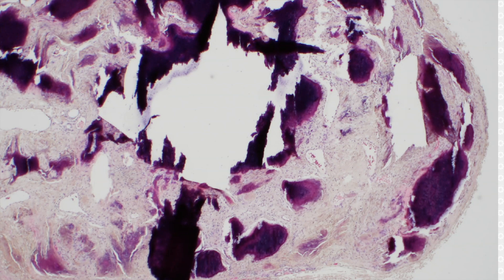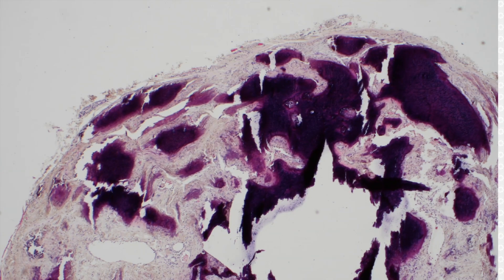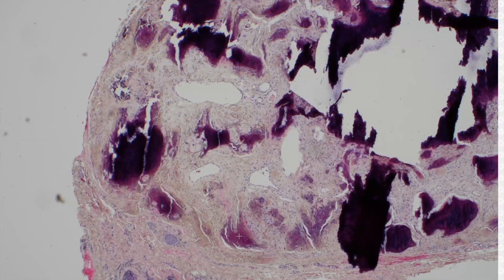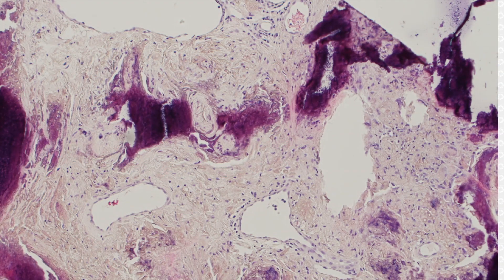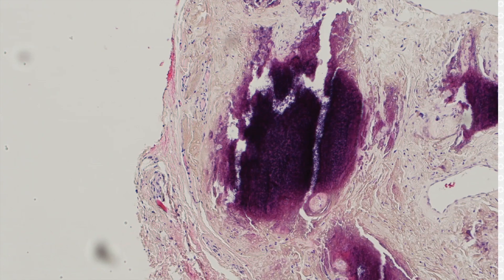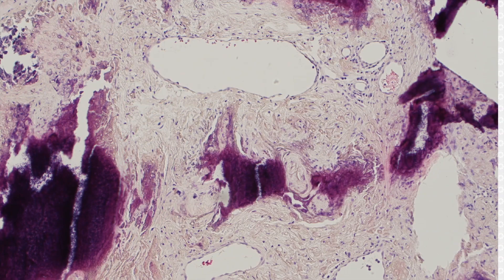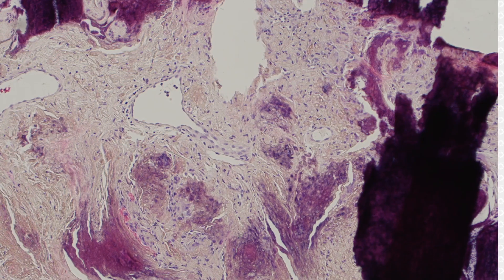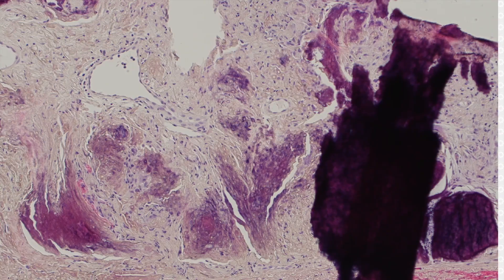What do you do with this? Pilomatricoma. A lot of times people struggle because when they're totally calcified, like this, pilomatricoma — when they rupture and totally get calcified — can get confused with calcinosis cutis because they've got calcium everywhere. I've definitely had multiple times where I've been able to trick my trainees into calling them calcinosis cutis.